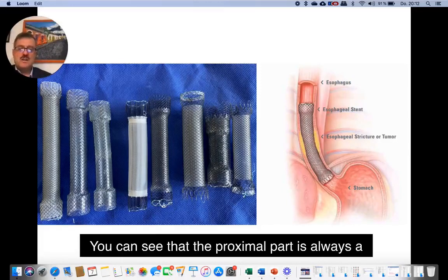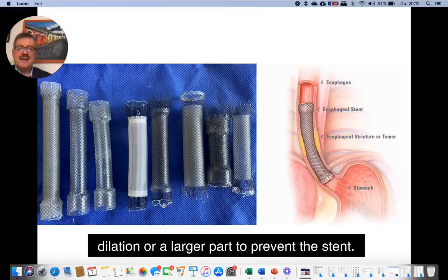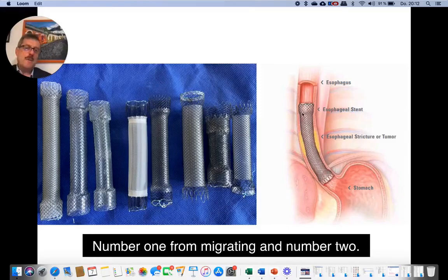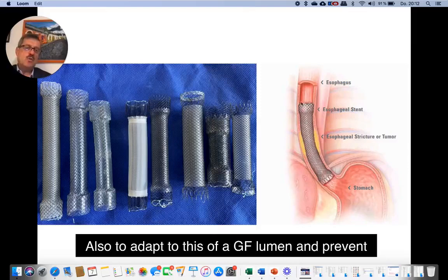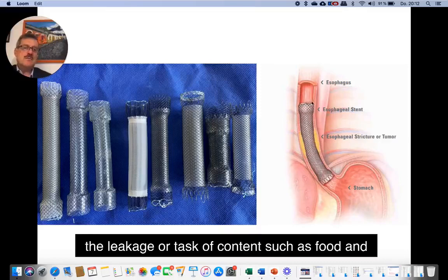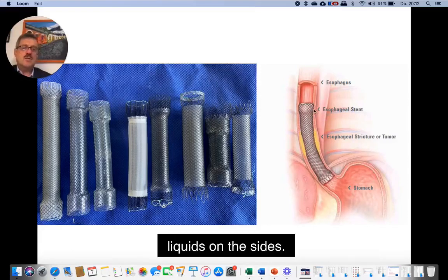Other important aspects about the anatomy of stents: the proximal part always has a dilation or a larger portion to prevent the stent from migrating, and also to adapt to the esophageal lumen and prevent leakage or passage of contents such as food and liquids on the sides.